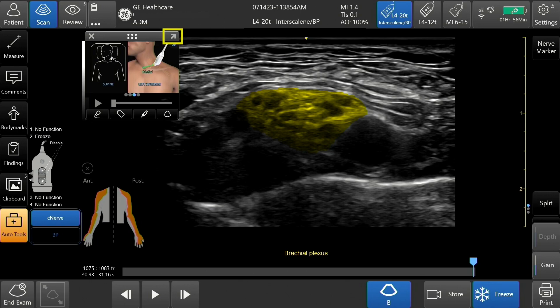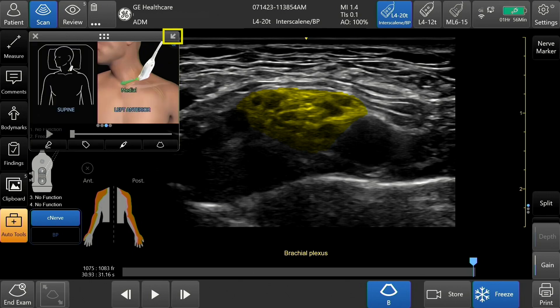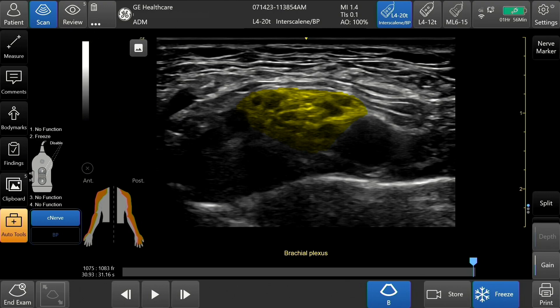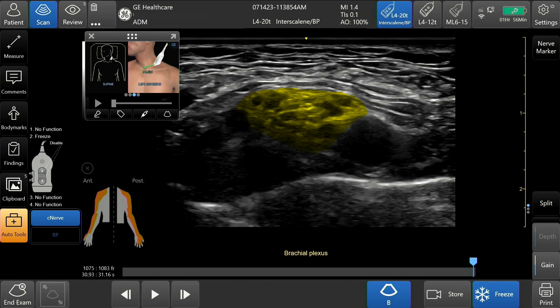Swipe right or left on the reference image to change view and side. Make the image display larger by tapping the enlarge button above the window. Tap again to return to the original size. Tap the minimize button in the upper left-hand corner to hide the graphic. Tap the picture icon to view the image display again.